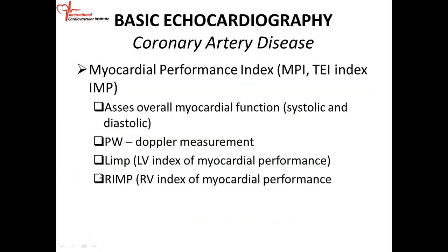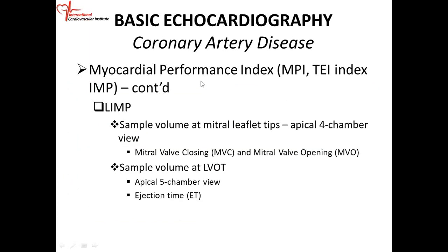So we did it when we did RIMP, when we did the right heart, and for the left heart it's called LIMP, left ventricular index of myocardial performance, the so-called TEI index. Okay, so what we do, and it's a simpler test. It's simpler if you're doing it on the left side as compared to the right side.